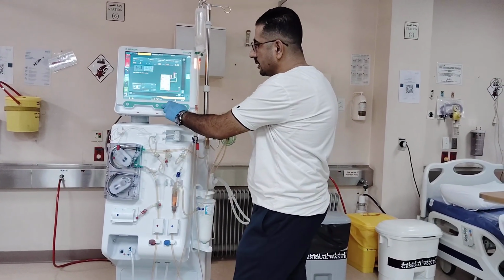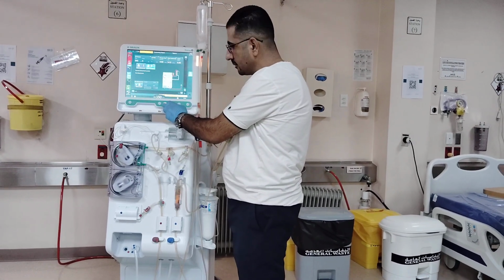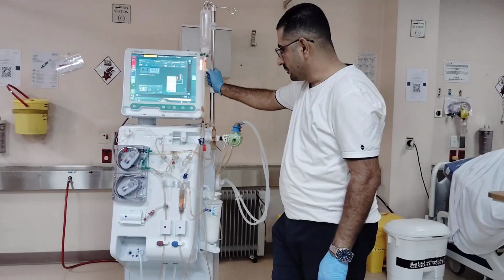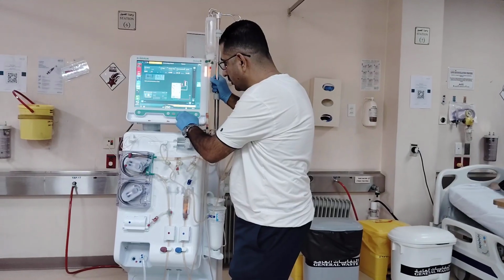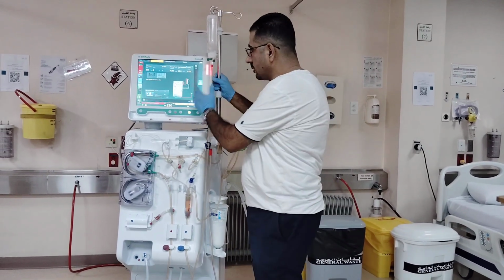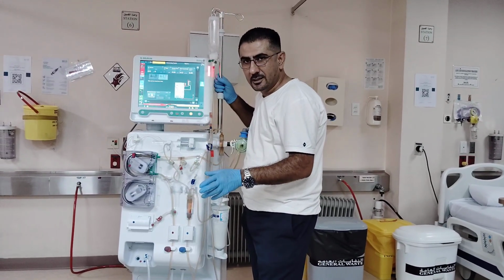Start the blood pump. When you see this light, it means the blood pump is stopped, so you have to activate the blood pump. Now you can start increasing the blood flow, 250, now 300. Usually with a real patient, the bypass will release automatically.